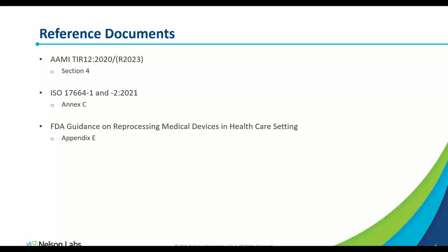And so while you're designing your device, I would definitely reference the portions of these documents, have them easily accessible or readily available, so that as you're designing the device, you can cross-check it against some of these design features that are listed in these documents, and you can get an idea of how difficult it will be to clean the device or disinfect the device or even sterilize the device.